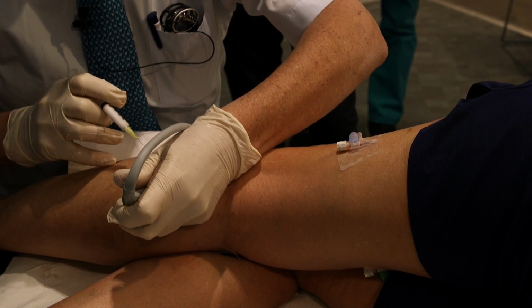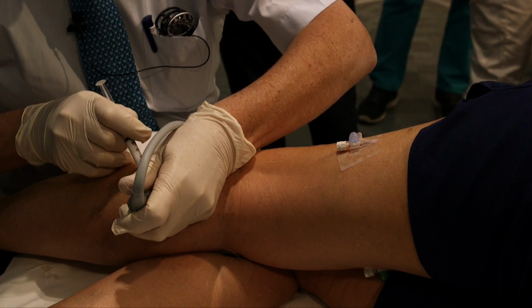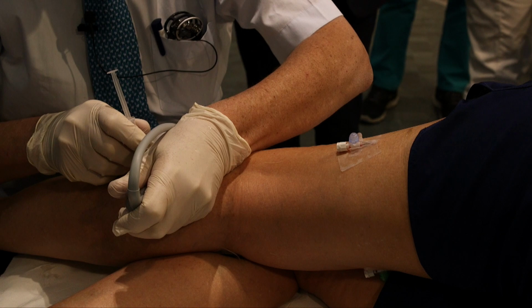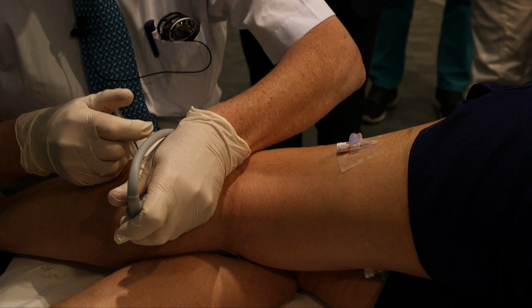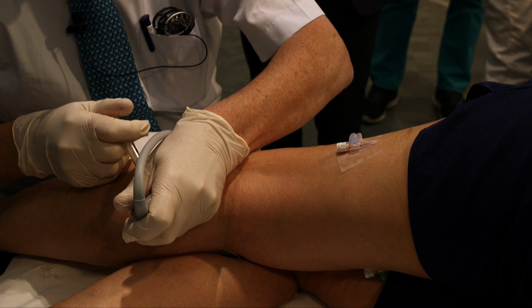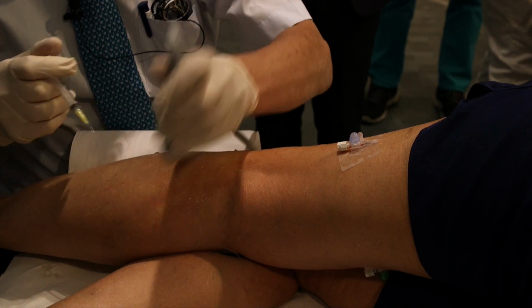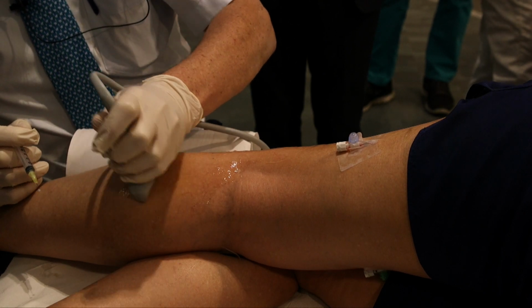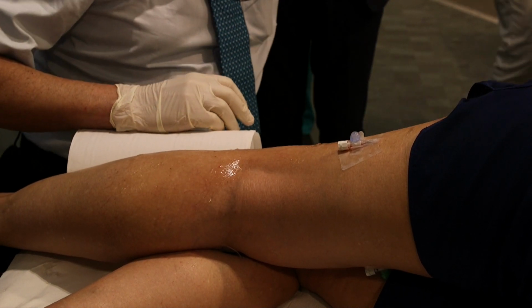That's an interesting structure there. I'm just going to plant an injection in there. So this is a longitudinally running superficial varicosity, effectively, which will benefit from some foam. So there's foam going into the varicosities there. And now most of those varicosities seem to have got some foam in, so most or all of them will be destroyed. So that's pretty good. I'm pretty happy about that. Right, now we're going to foam the perforator and superficial trunk.